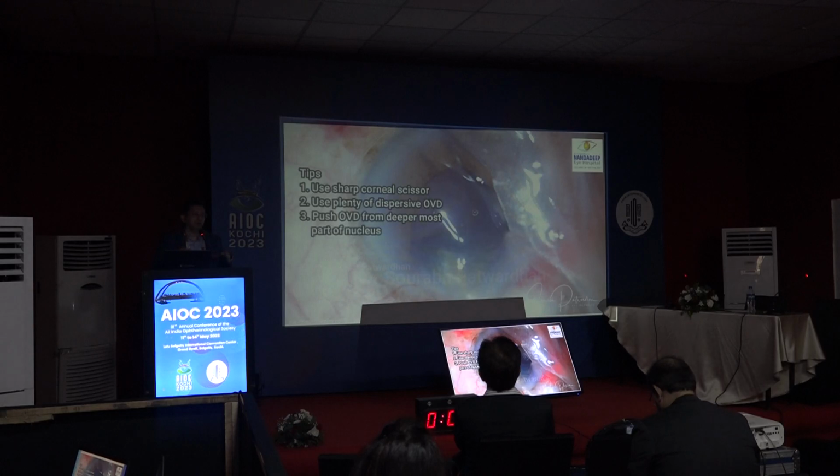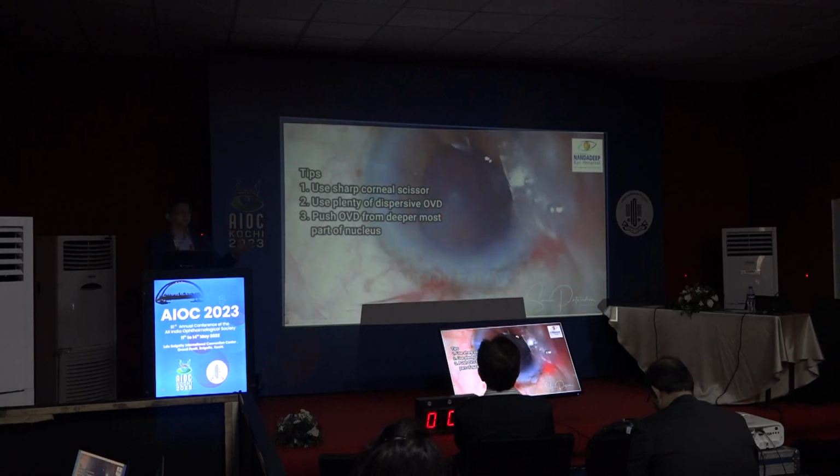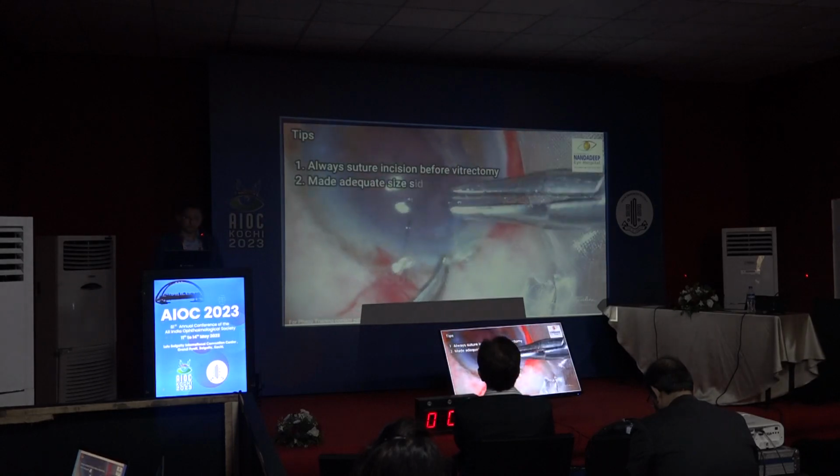They try to keep the anterior chamber maintained, because that is your instinct. When you are doing cataract surgery, you try to keep maintaining the chamber, and unfortunately they push more viscoelastic in front of the nucleus, or when they go behind also, they don't reach the posterior-most or deepest part of the nucleus, and then you may have a situation where one of the nucleus pieces drops down.